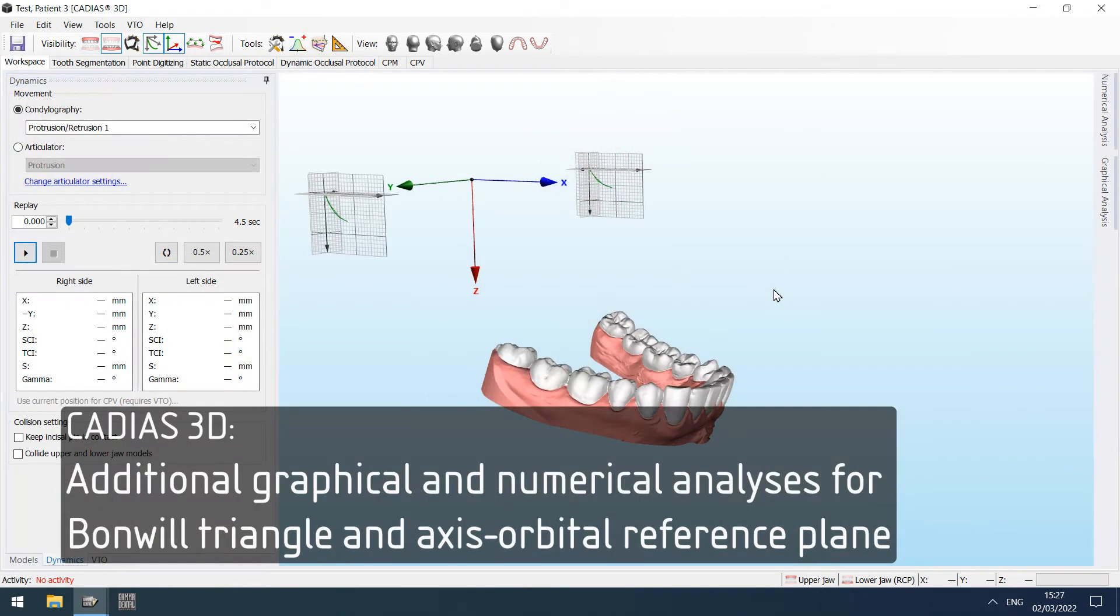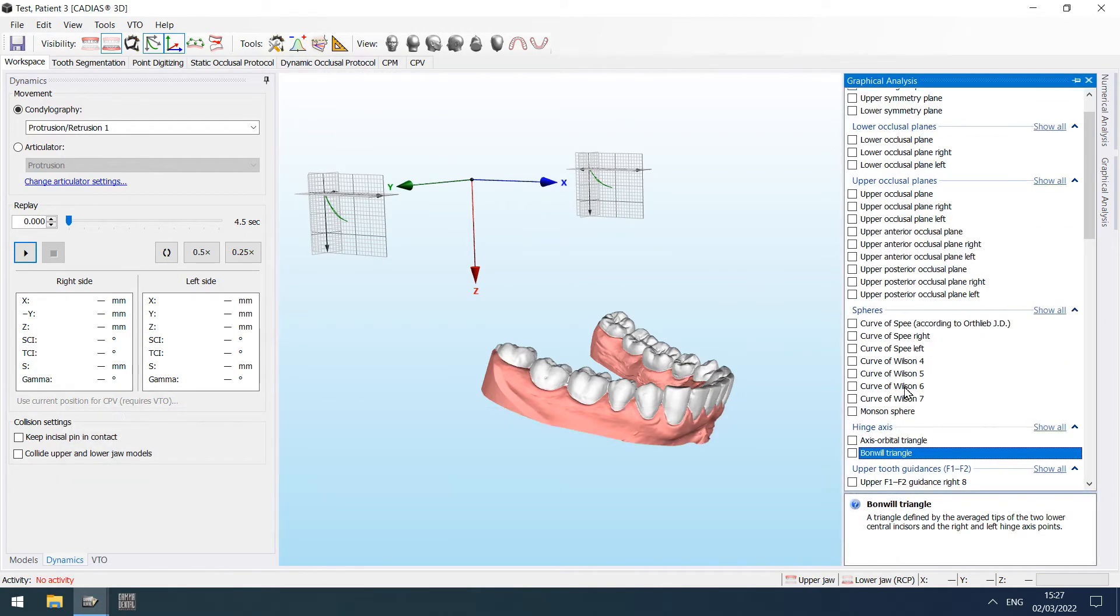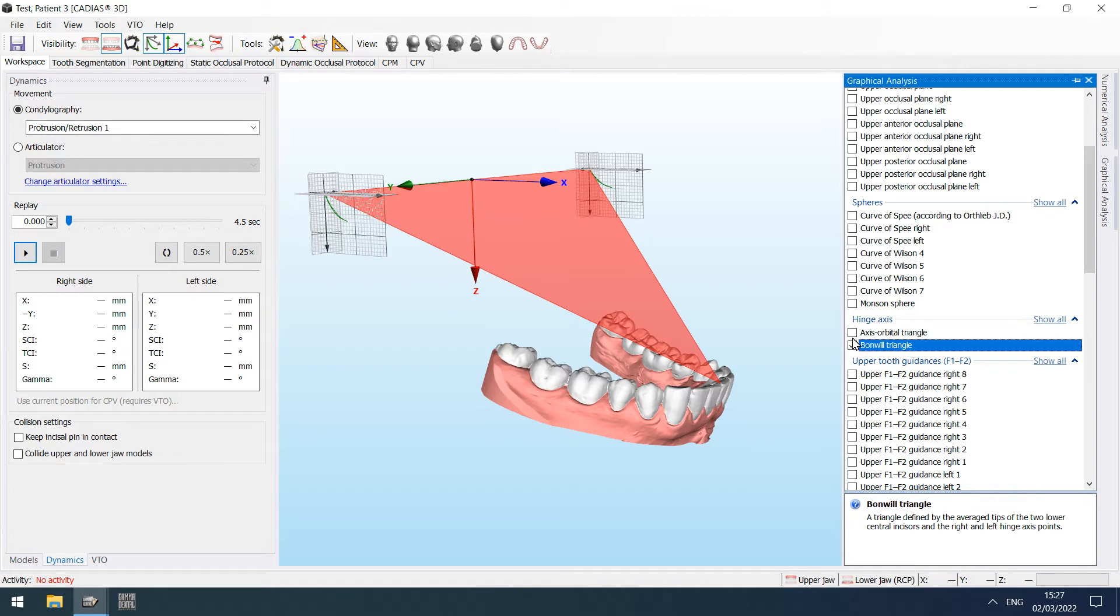The graphical analysis now includes visualizations of the Bonwill triangle and the axis-orbital triangle, which can be animated together with the lower jaw model.